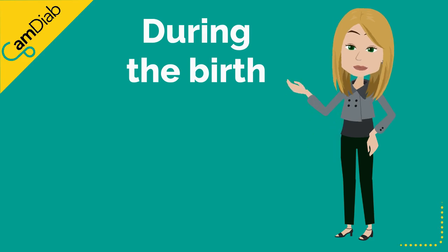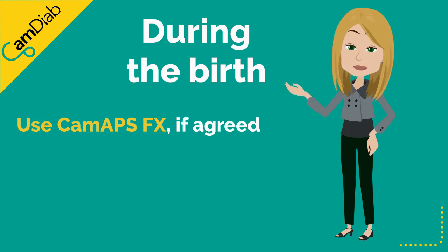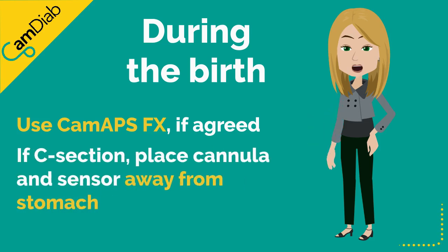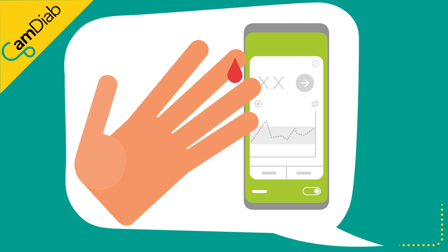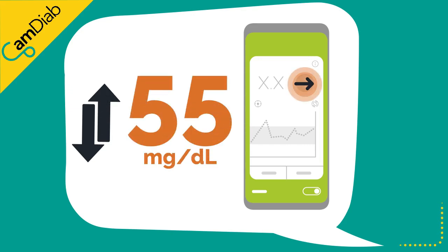During the birth, CamAPS FX can continue to manage insulin delivery, if agreed with your healthcare team. If a C-section is planned, please make sure you place your cannula and sensor away from your stomach. Please also check the accuracy of your sensor and calibrate or replace it if the sensor is reading more than 55 milligrams per deciliter above or below your blood glucose reading when your sensor arrow is stable.